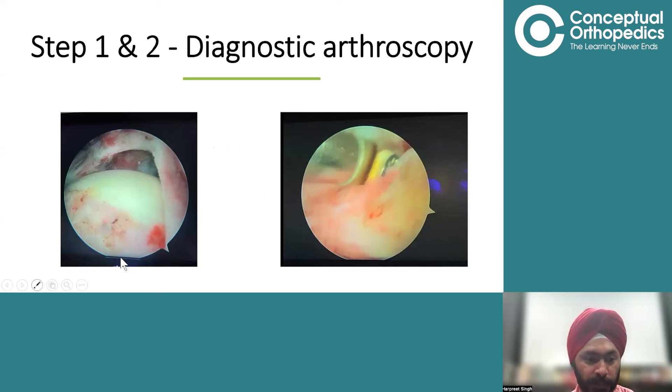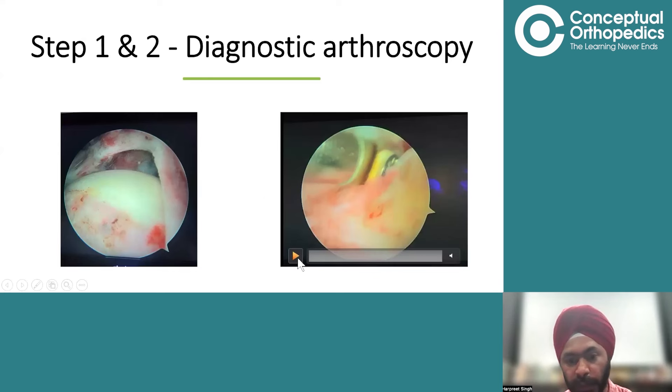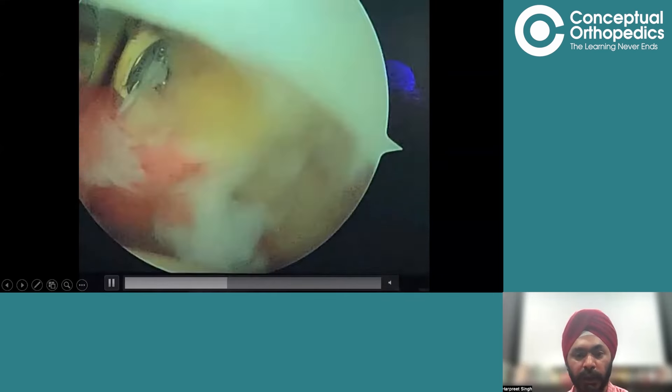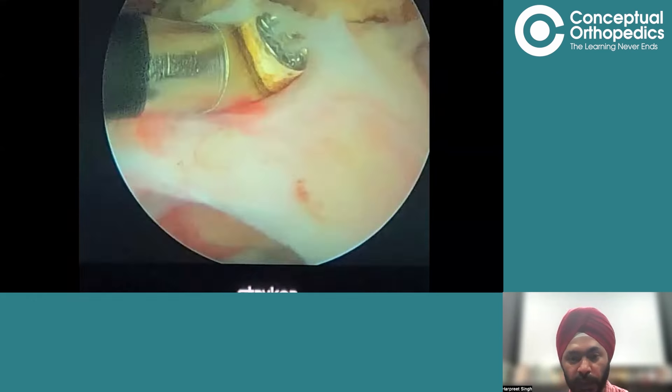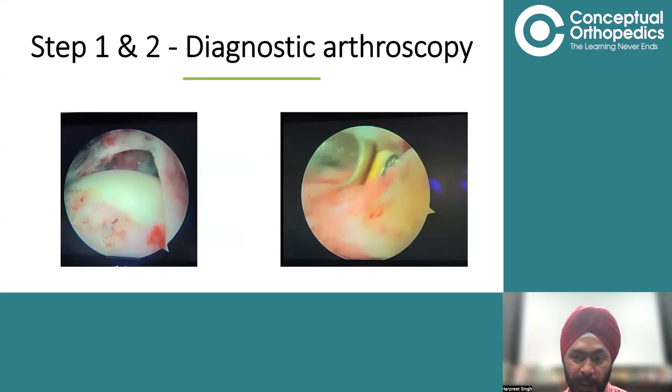This is step one in the video. We performed the diagnostic arthroscopy and can see a big cuff tear — this is the greater tuberosity, this is the humeral head, and inside you can almost see the glenoid. It is a massive cuff tear almost reaching up to the glenoid at the apex. When we tried to bring the cuff edges onto the GT, they were not coming and it was tearing further. Step one is diagnostic arthroscopy, step two is to assess any possible repair, and the subacromial decompression is also performed here.